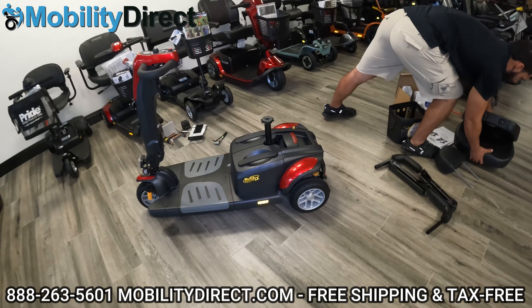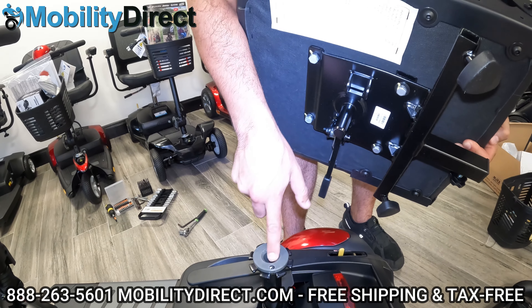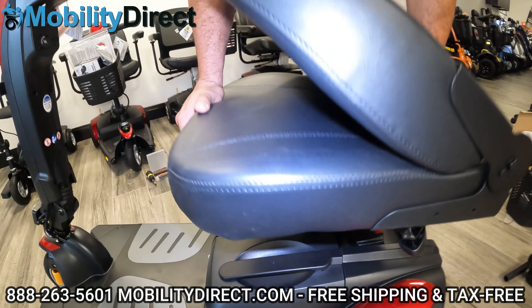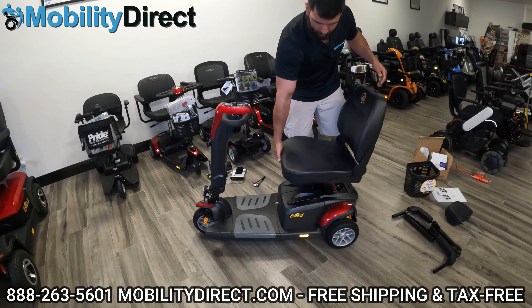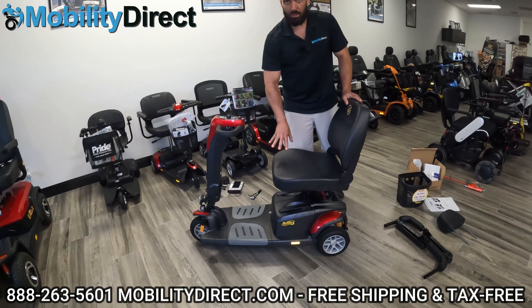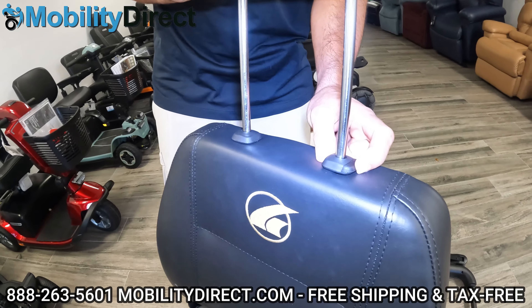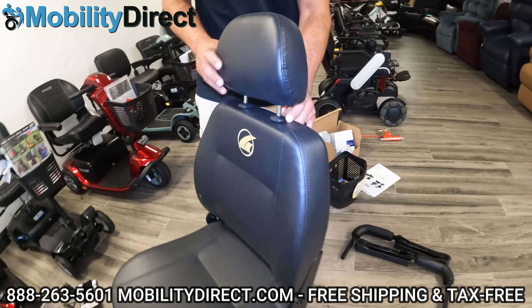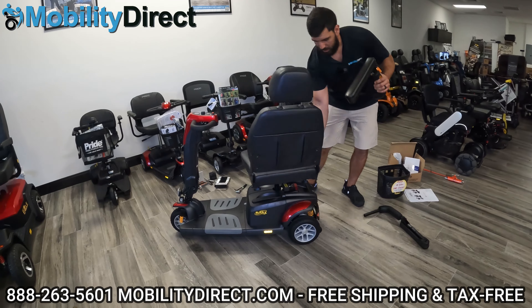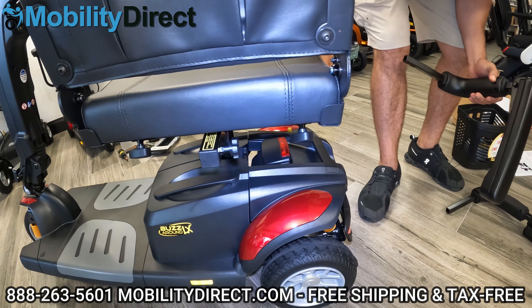I'm going to grab the seat base now. Remember, there's a male connector at the bottom of the seat — that's the female connector on the seat post. It's coated in a rubbery poly material, so when you put it in, it grips really well and doesn't come out easily. When you go to remove the seat, you have to pick straight up — if you're tilting it, it won't come out. If you pick straight up, it comes right out. That keeps it secure and strong. Next, grab the headrest — it's just like an automobile headrest. There's a little button to adjust the height and it clicks into place wherever you want it.